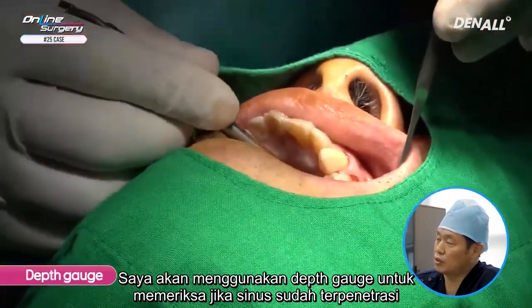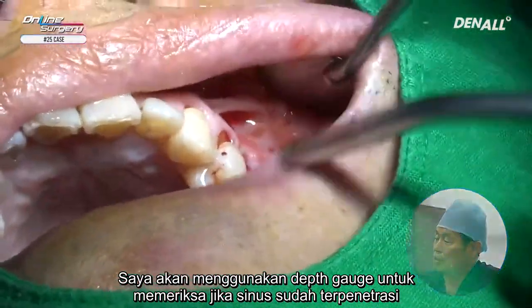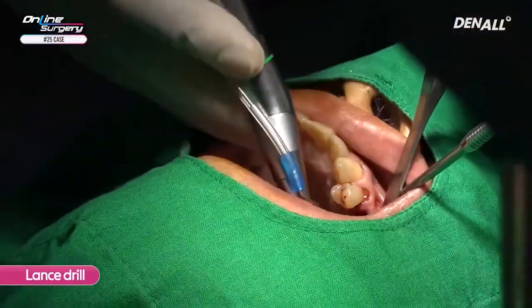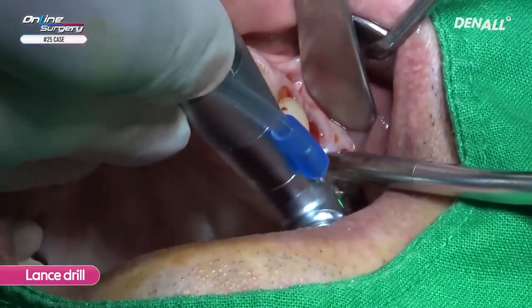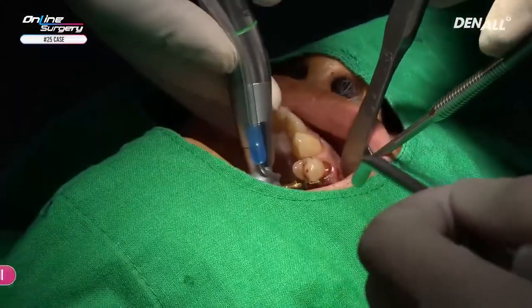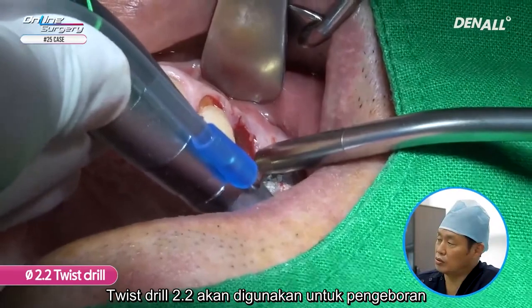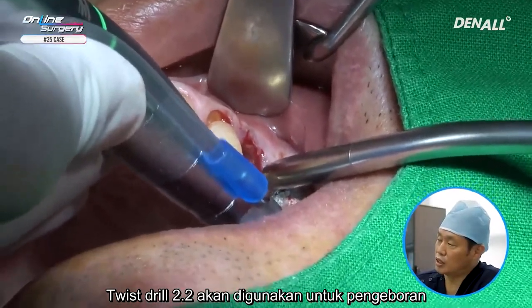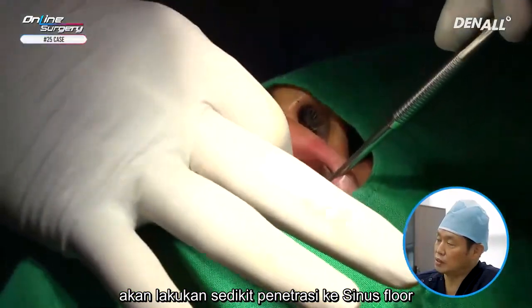I'm going to use a depth gauge to check once again whether the sinus has been penetrated. A 2.2 twisted drill is going to be used for drilling. The sinus floor is going to be slightly penetrated.